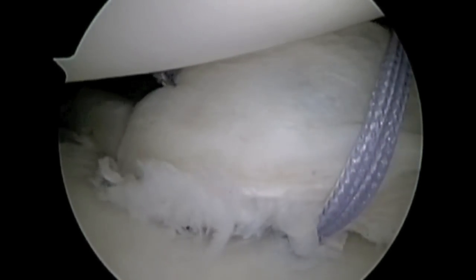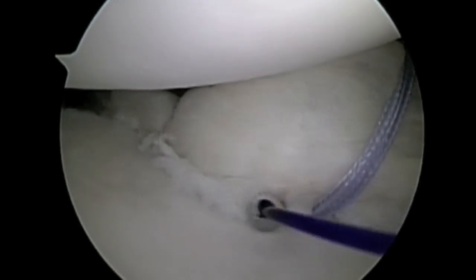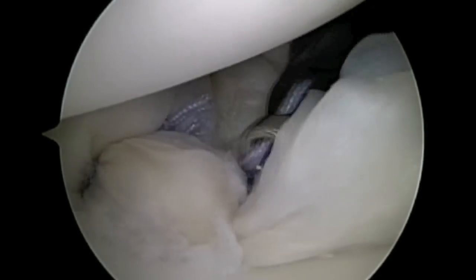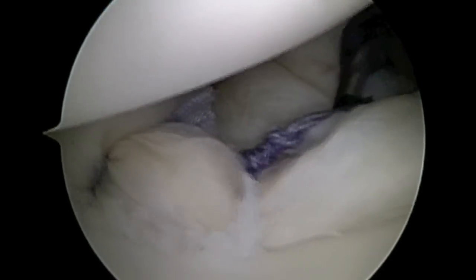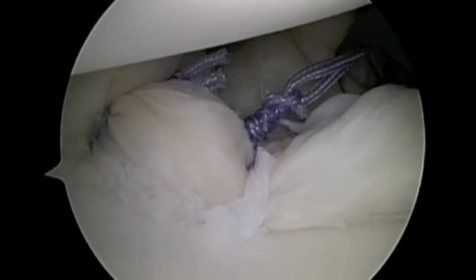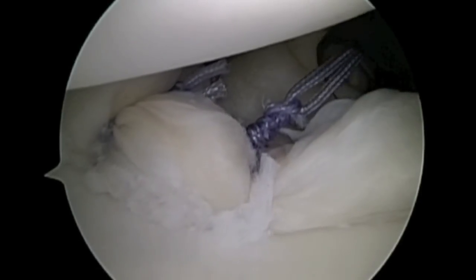This process is repeated with a second suture anchor. The knots are tied down and we take care to keep the knots away from the face of the glenoid and on the other side of the labrum. The suture is cut short.